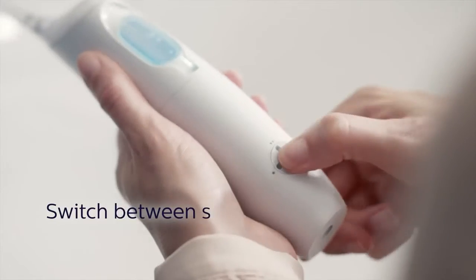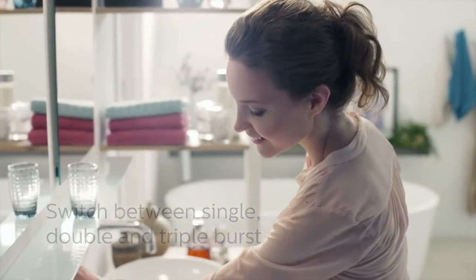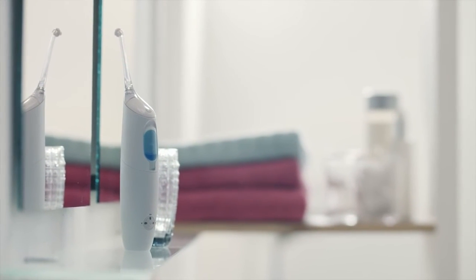If triple burst mode is not desired, you can switch between single, double, and triple burst by pressing the mode button once for each mode. The indicator LEDs show what mode is activated.